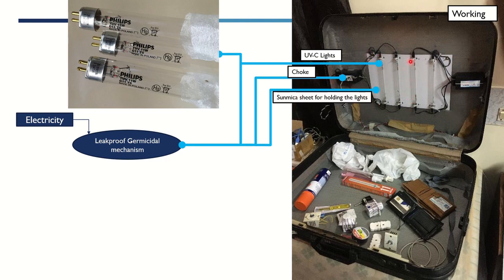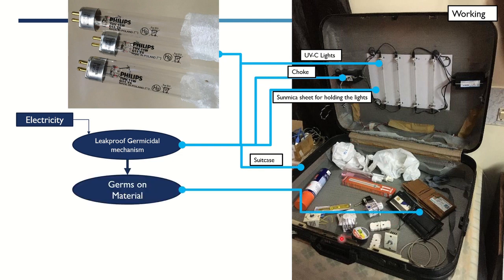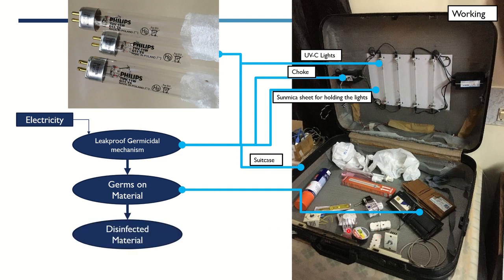These are the chokes required to run the lights. I've used a Sun Mica or small plastic sheet to hold them, secured with plastic ties. You can use any old suitcase — it doesn't have to be hard, it just needs to contain the light inside. All the materials you think may have germs on them go inside this cavity, then you close it and start it, and the system gives you disinfected material — that is our basic purpose.